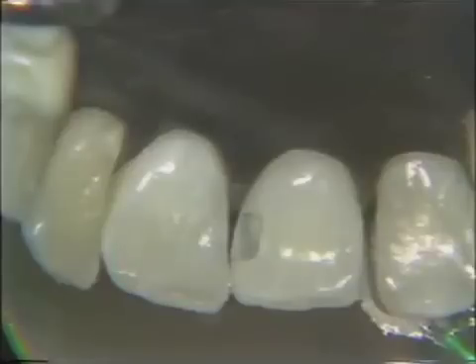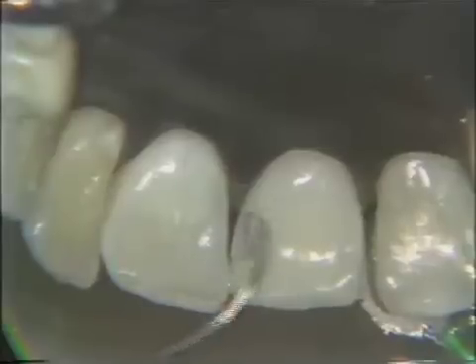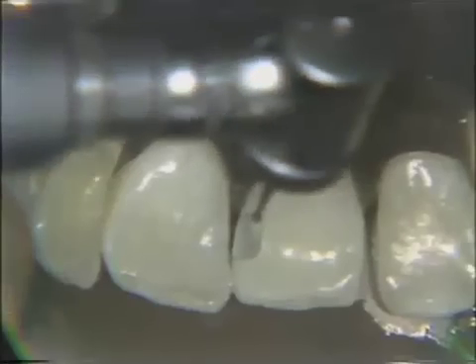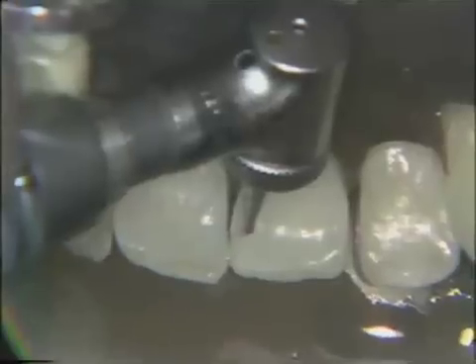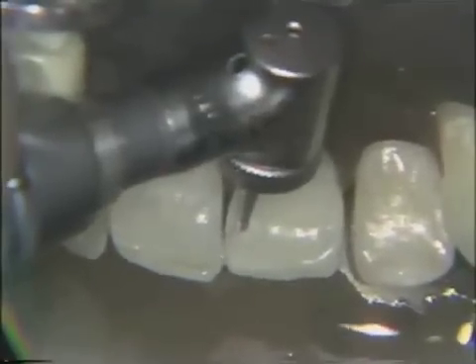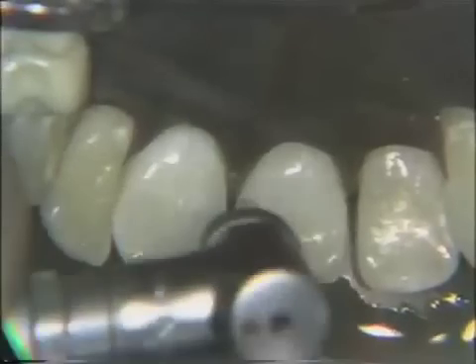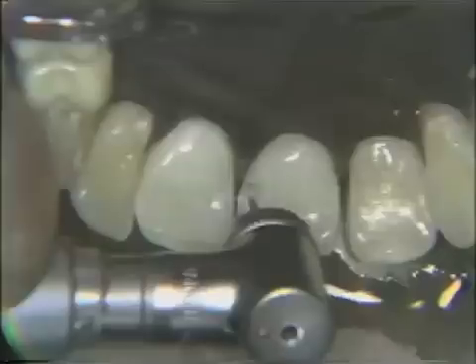The cavity preparation is now ready for its refinement and retention. We first of all check to see that there is no carious lesion remaining. Check your dento-enamel junctions very thoroughly with an explorer and also by inspection. Now with a half round burr or a quarter round in some places, we will now start our retentive groove. The retentive groove is the slightest in the incisal. It gets a little larger in the labial portion and then becomes rather prominent at the cervical.